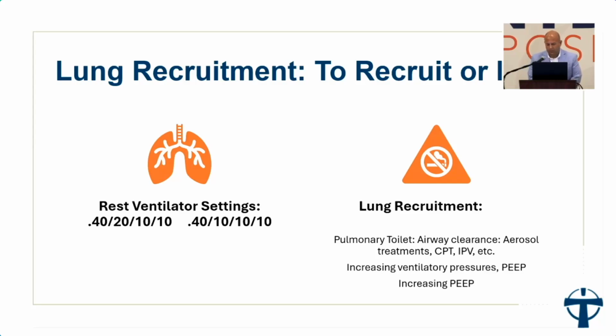So let's talk about lung recruitment and pulmonary toilet, right? Airway clearance, aerosol, CPT, IPV, you can bronch. We bronch our patients at least once a week if we think it's mandatory, or if we think it's not mandatory, if it's beneficial. And a lot of places will increase vent settings after a while. They'll say, hey, does our X-ray look a little better? Do our blood gases look good? Do you want to go up on our pressures? Do you want to go up on our PEEP?